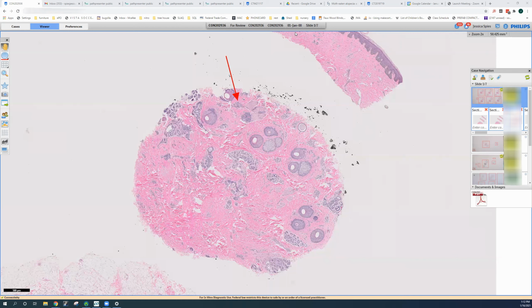Just a few heads up for syphilis. There is quite a bit of explanation in the chapter of subtle histologic differences between the different stages, which I really don't think is important for you to know. The histologic diagnosis depends on finding the spirochete with special stains in the biopsy, but in practice, it also depends in part on clinical suspicion, as syphilis can have such a wide range of histologic features and may mimic many other dermatitis on biopsy, kind of similar to how it can mimic different diseases clinically.